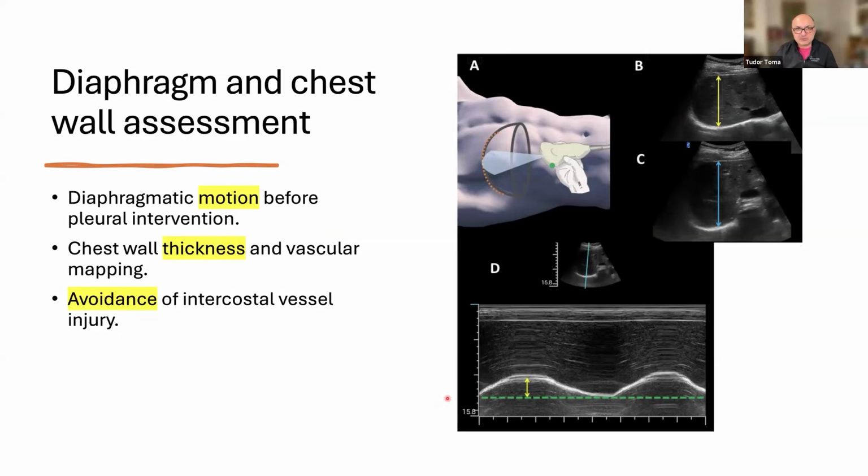However, the opposite is true if the diaphragm movement is completely abnormal, if there is no correct pumping movement of the diaphragm, if there is some flickering of the diaphragm, then the drainage is required, and it will make a difference to the symptoms of these patients. To assess the diaphragm with the ultrasound, especially if you have a pleural effusion, is not difficult at all.